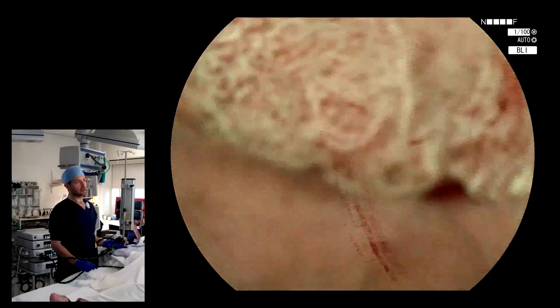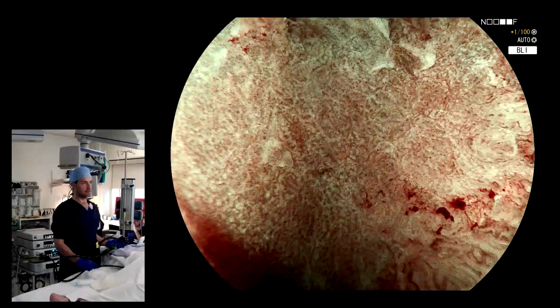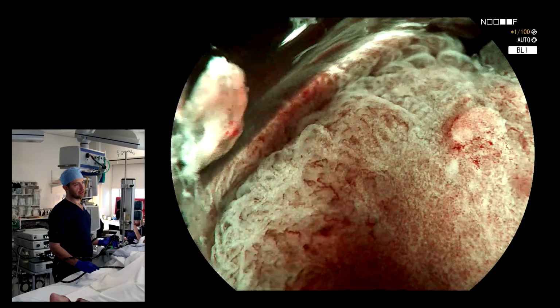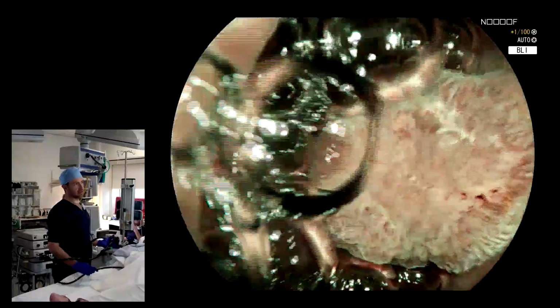And so what I think is very important is to be able to describe these patterns, not in terms of, okay, this is a JNET X, Sano Y, Hiroshima A pattern, but whether this pattern is completely disordered or whether it is in between regular and completely disordered, so regularly irregular. And I think that's what I'm seeing here. That combined with the slight depression makes you pretty concerned that this lesion is one, invasive cancer, and that there is a chance that this lesion is deeply invasive.